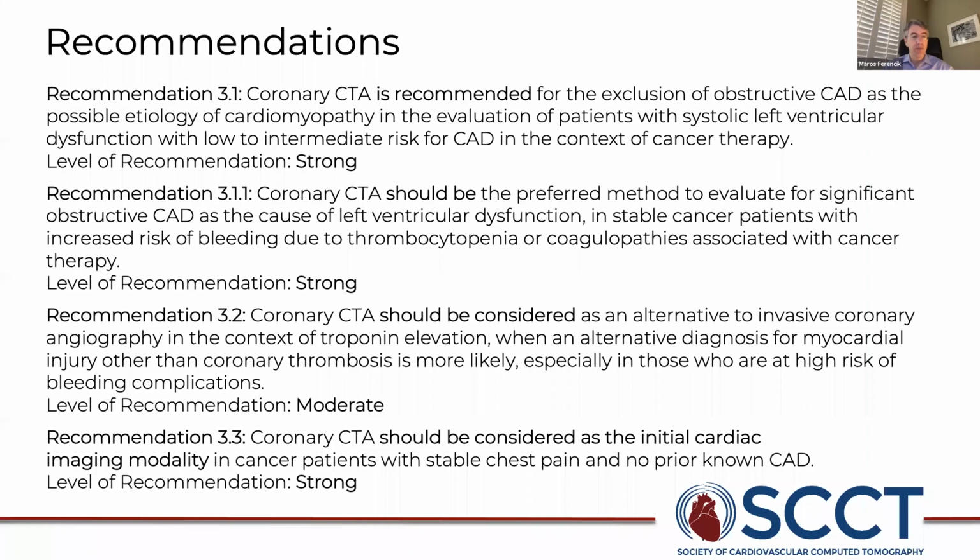Recommendation 3.11 is that coronary CTA should be preferred in those patients that are at a higher risk for invasive coronary angiography in cancer patients, specifically patients with low platelets or coagulopathies. CTA should be the preferred method.